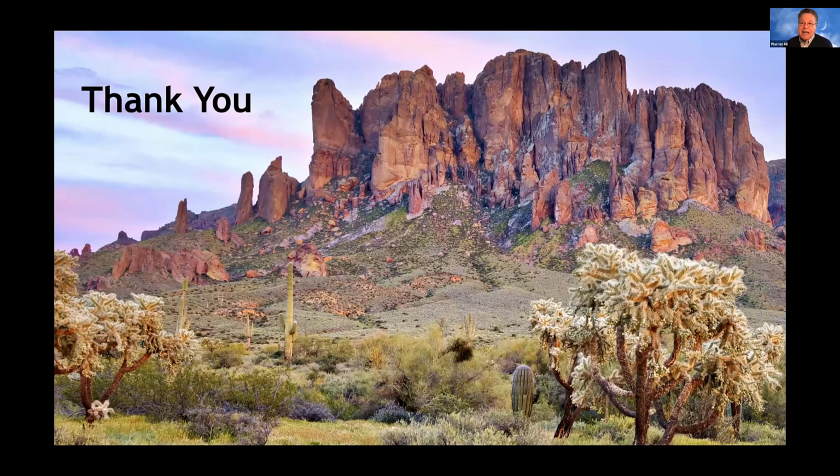It was like the heavens opened up and we didn't have to worry about that anymore. My hope is in the next few years, there's going to be another advance like that on the horizon that's going to make things better for the Ks. And again, for those of us that develop lens power calculation methods, the Ks are probably the most problematic area.